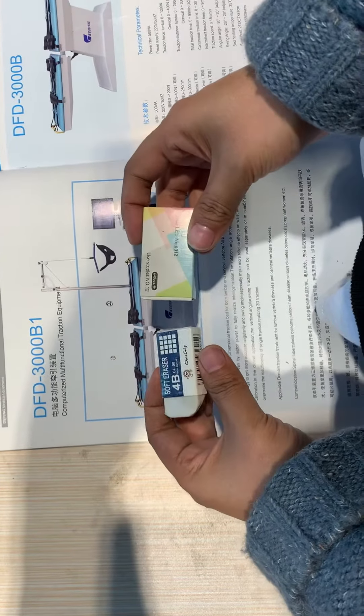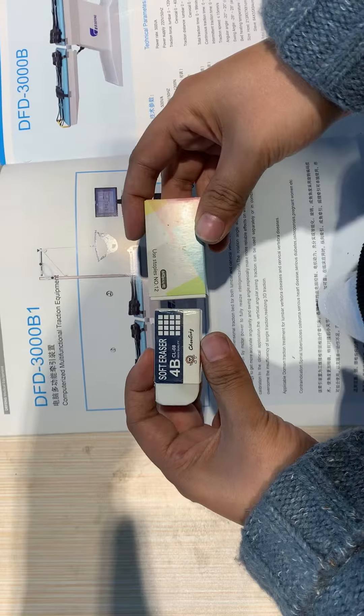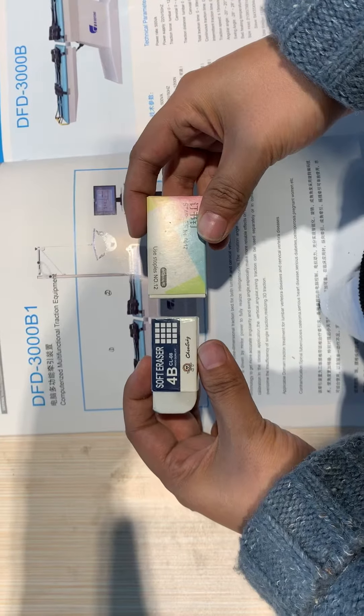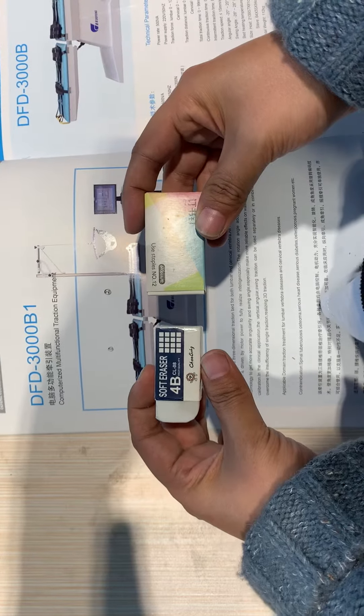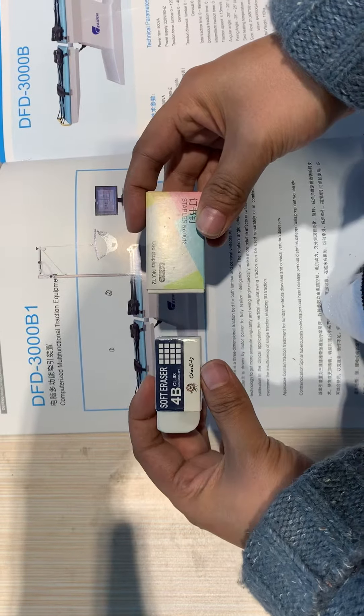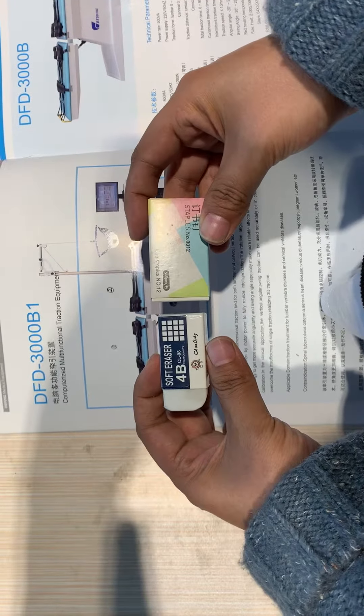The first function of the DFD-3000B1 is flat traction, as shown here.